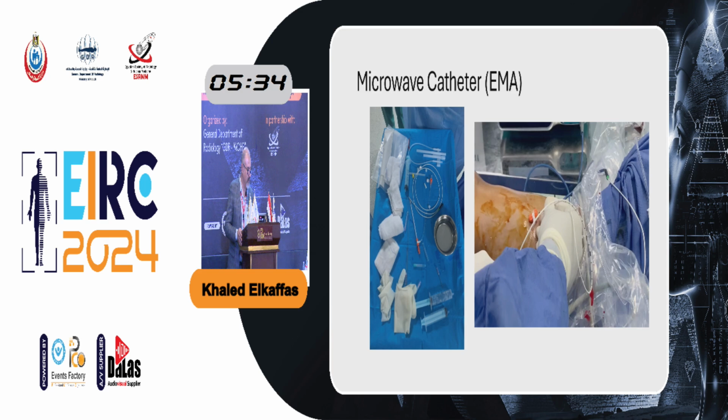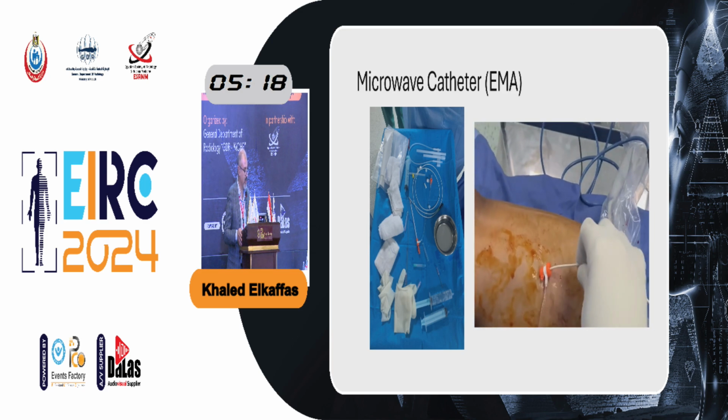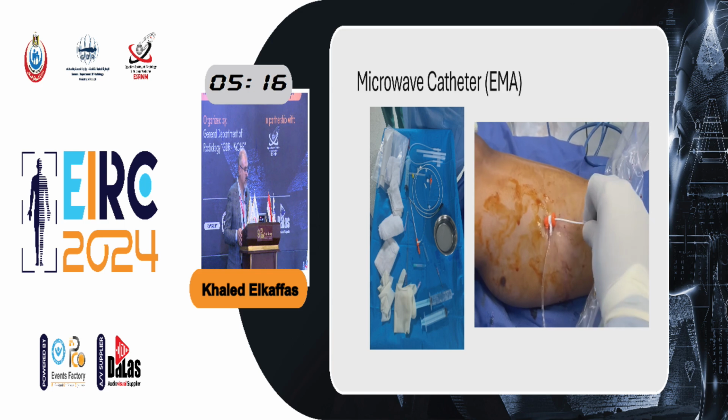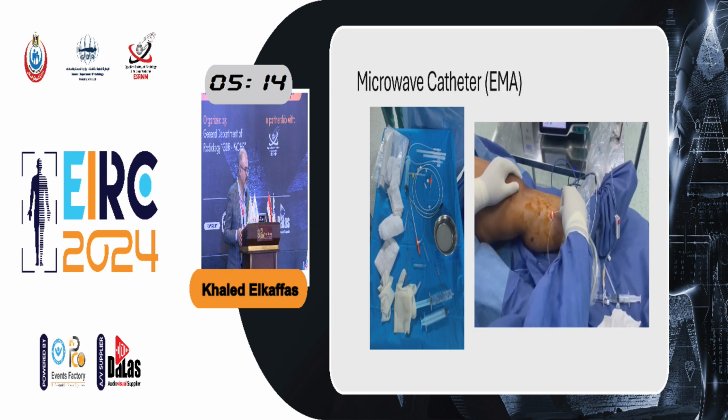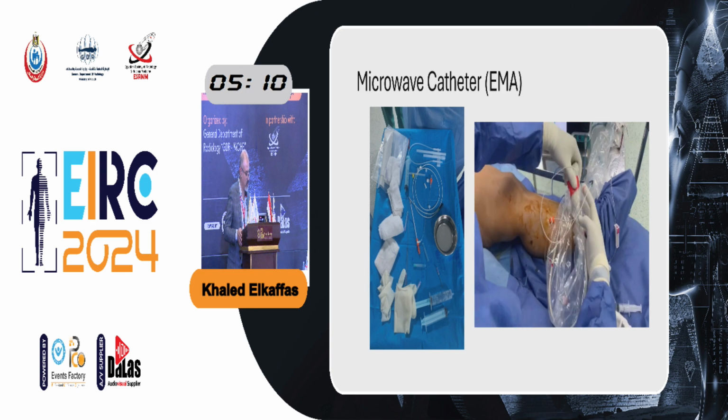Now to the microwave. It's a Chinese technology formed by a Chinese manufacturer. Here's the setting of the microwave catheter. It has a short heating element, about 1 centimeter, and it looks like laser, but we ablate 1 centimeter by 1 centimeter, not like radiofrequency, a long segmental ablation.